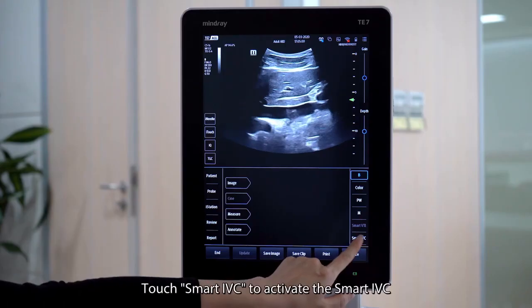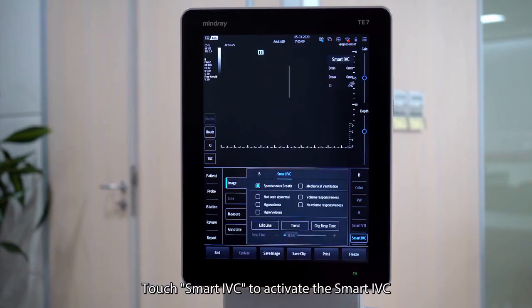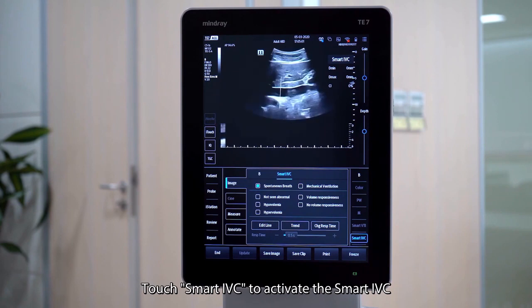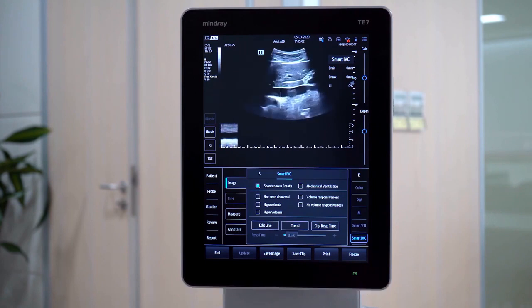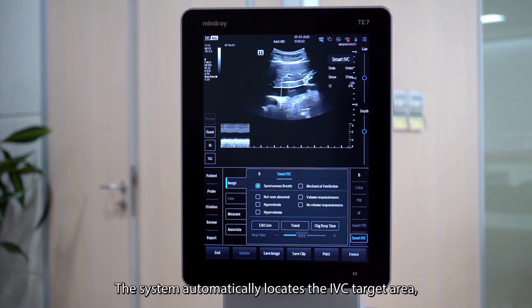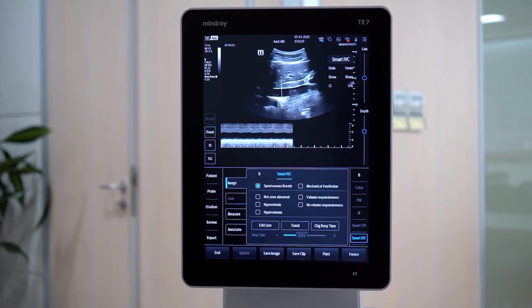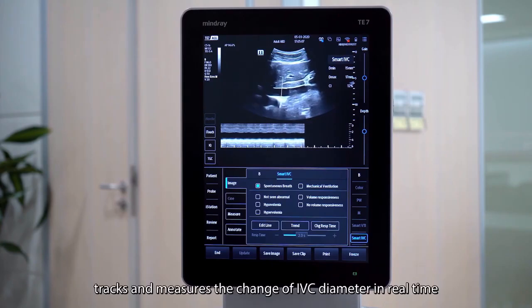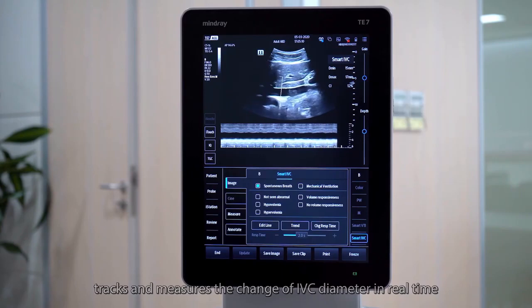Touch Smart IVC to activate Smart IVC. The system automatically locates the IVC target area, tracks and measures the change of IVC diameter in real-time.